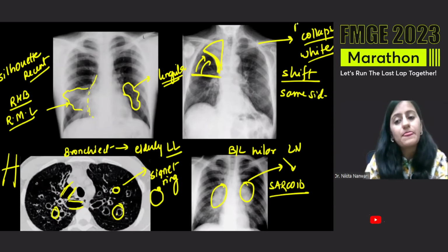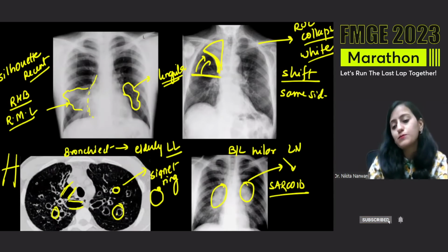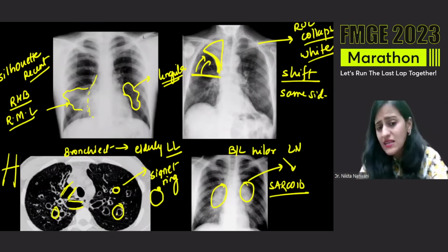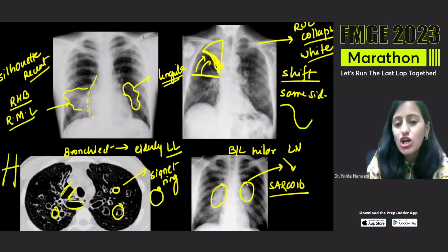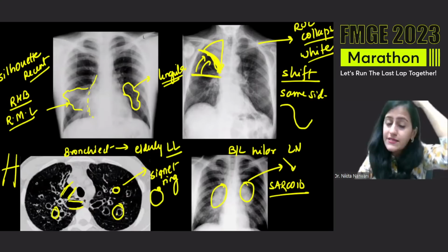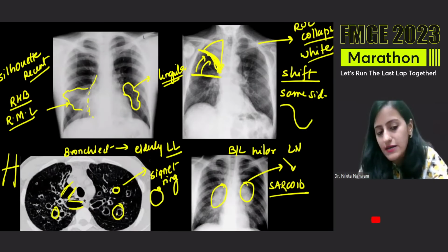So that is why this is right upper lobe collapse. It is not consolidation, it's collapse. You are not seeing the proper Golden S sign here, where you would see the fissure in an S shape. This is not the S. This is a routine concave fissure, which tells you it is not because of a mass there.